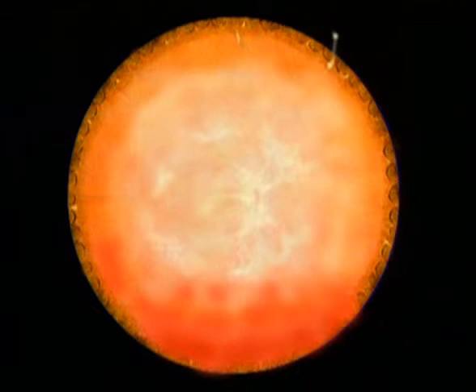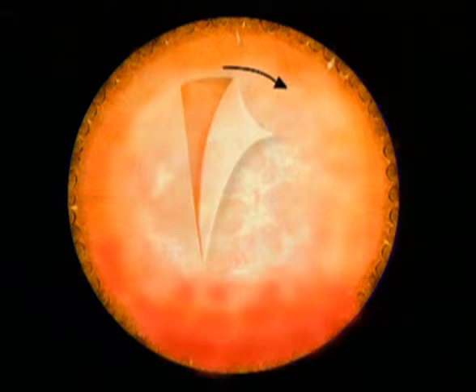In a second configuration, there are more severe proliferations spread out in the retroequatorial areas. We can do in the same way since we have the possibility to cut between the proliferation area and the vitreous base.